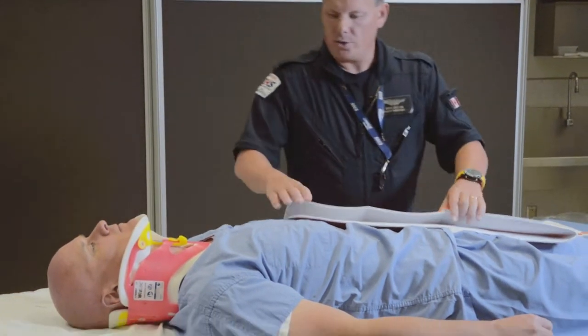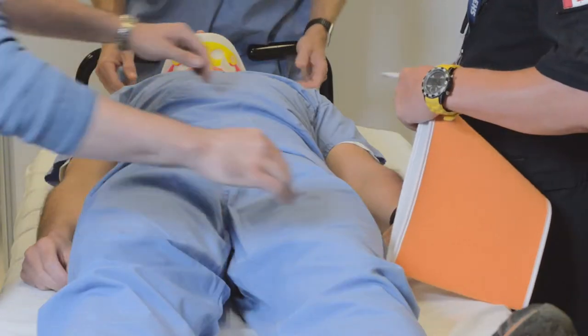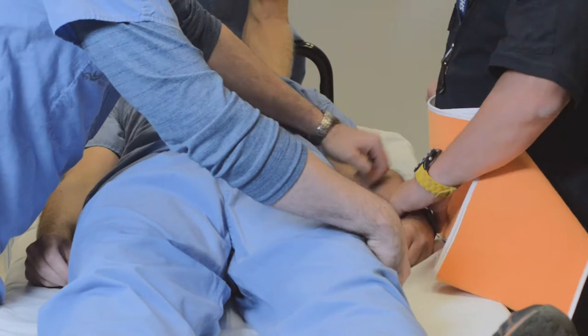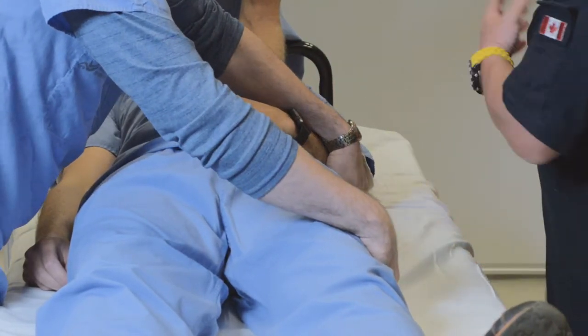The first thing we're going to do with this trauma patient is log roll him towards Jason and smoothly get this binder underneath the patient as easily as possible.